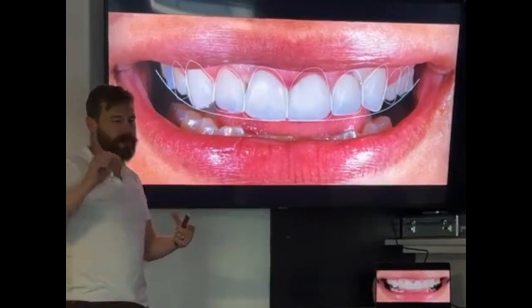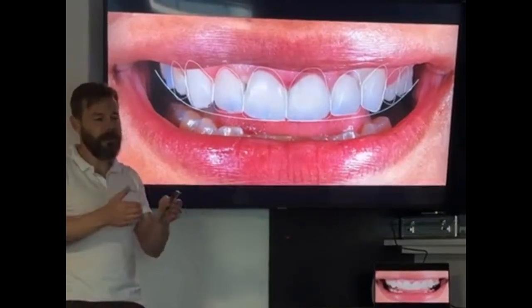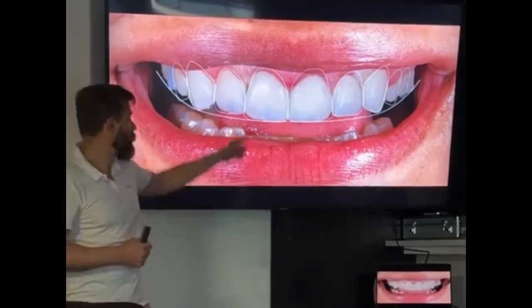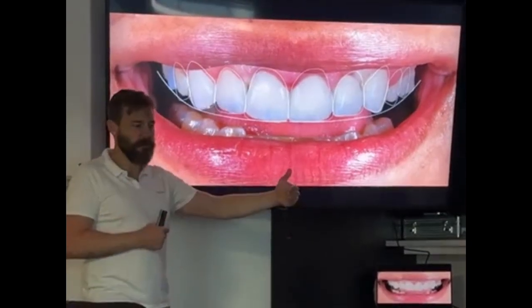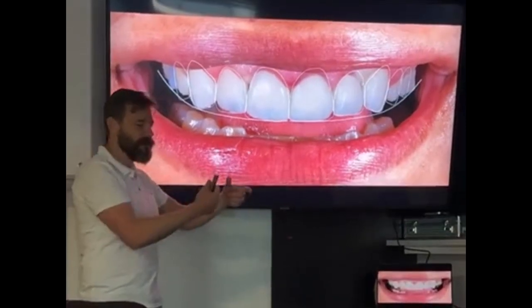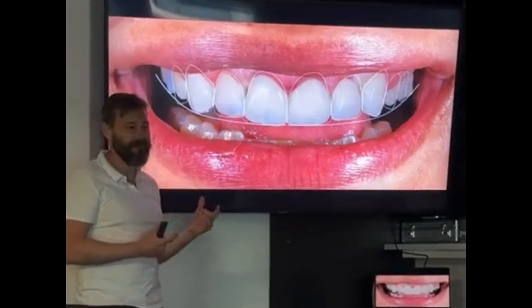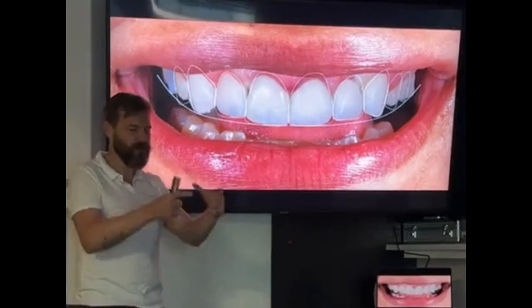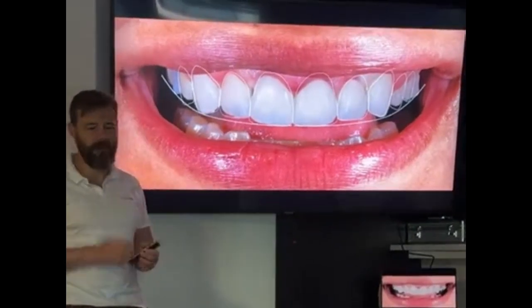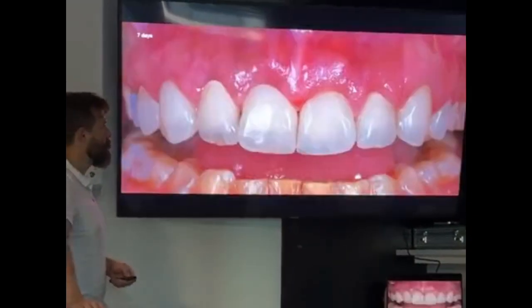And a good sealing zone is a balance between giving mechanical support without compression, and sometimes the PRF compresses the tissue, pushes the tissue aside, and it's going to take this place. And then you need to turn the PRF in the new tissue that you already had in place. So I prefer to really do the sealing zone on the provisional and put nothing under. So the arrangement is better than really trying something else.